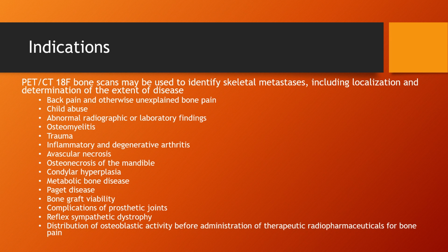So this would be ordered before something like a Xofigo therapy or anything like that where you're looking at therapy going to the bone.